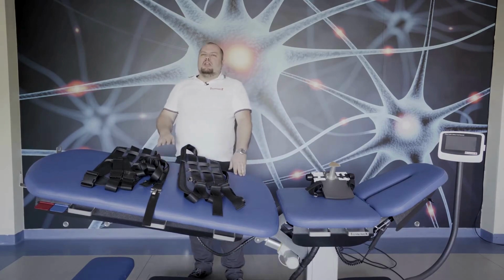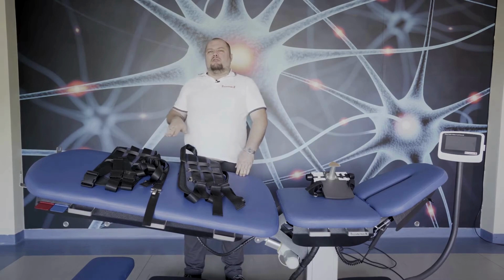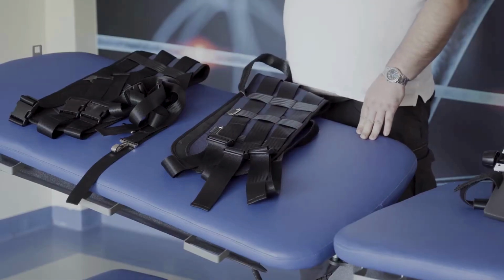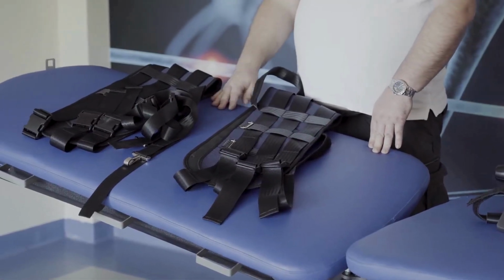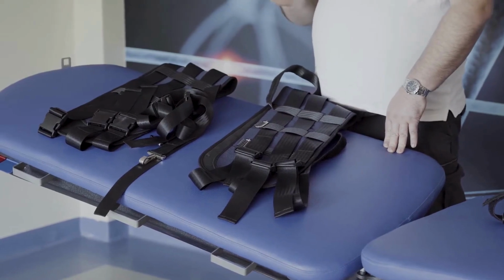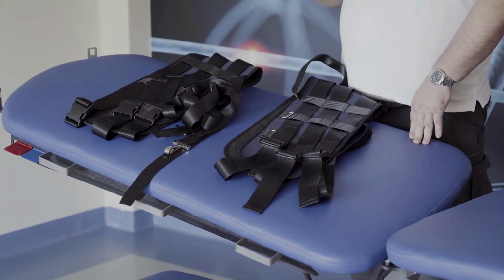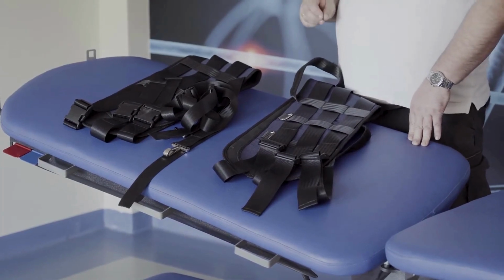Lumbar part or leg part. This is movable in three dimensions, and can be moved in the sagittal plane for more flexion or extension of the patient's lumbar spine. It may be rotated or side bent to achieve the best position for the patient and the most beneficial traction.